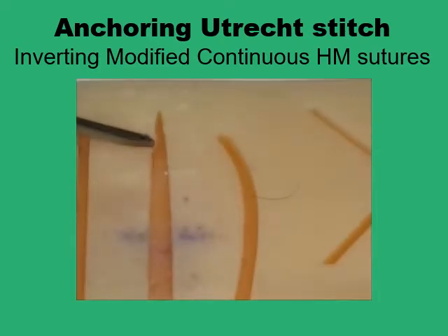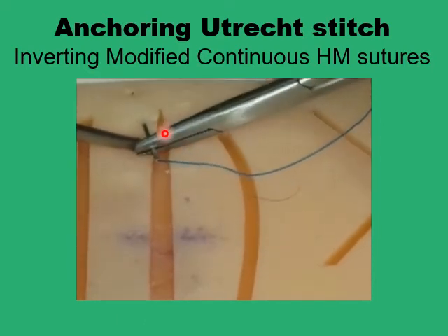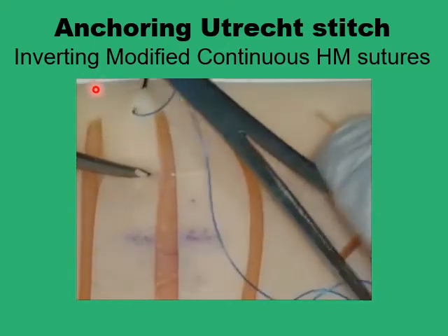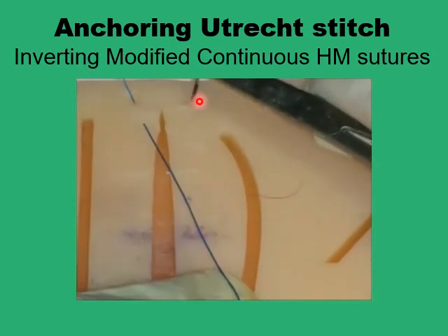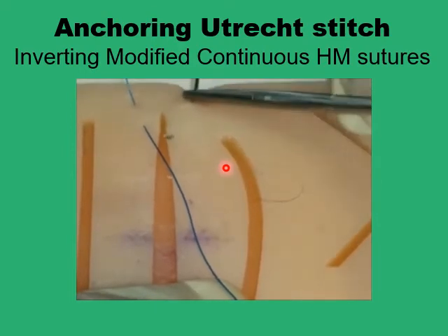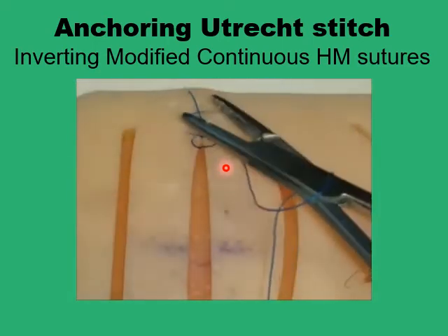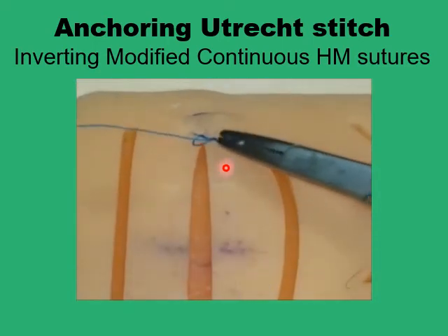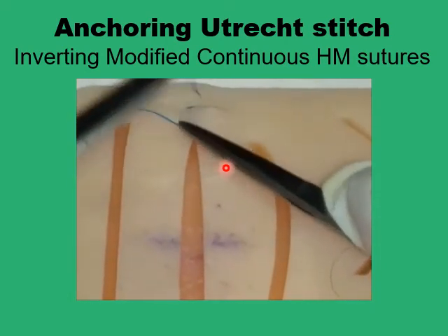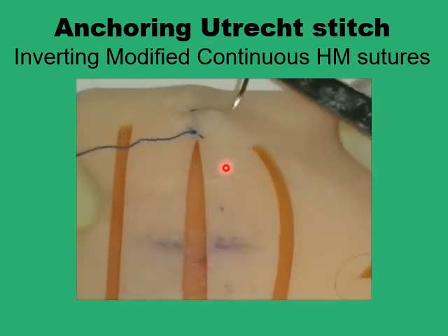The slight difference is that you pass the needle diagonally from near the wound edge to far the wound edge outside the apex, return back from far outside the apex to near, and you form the first horizontal mattress unit, but it's not a rectangle, it's much like a trapezoid with two parallel suture lines both perpendicular to the wound edge. You cut the shorter of the two and then you repeat the pattern again.